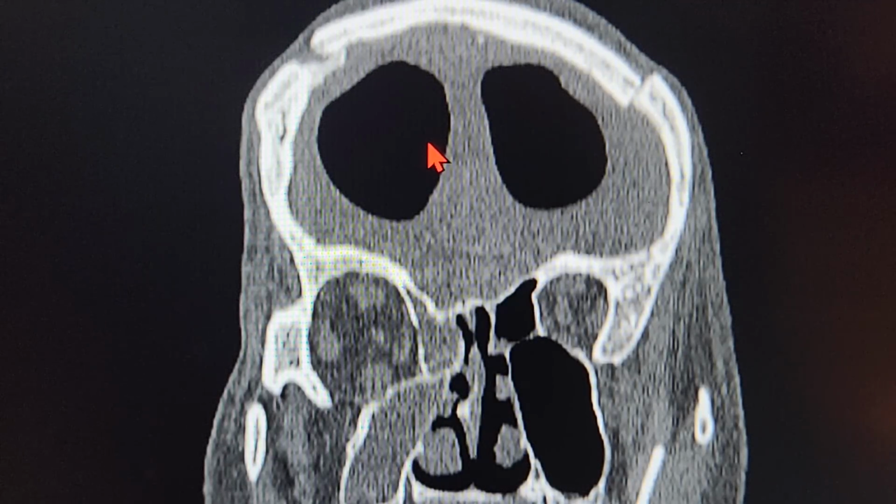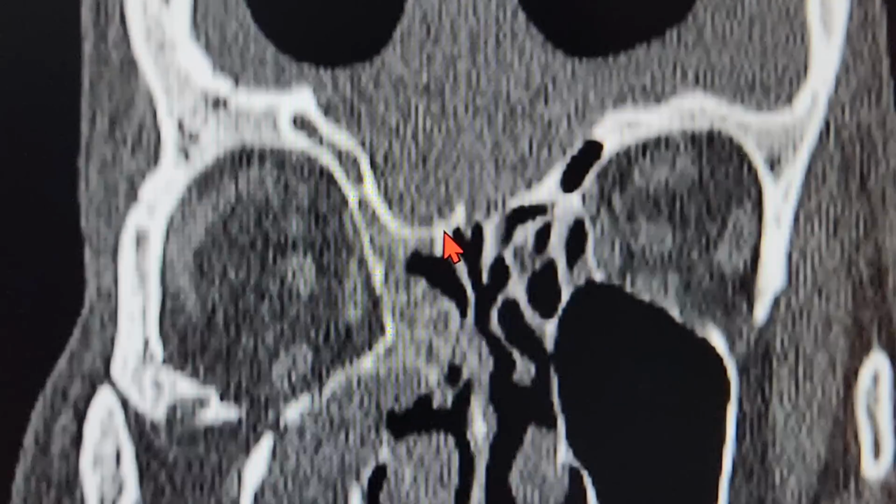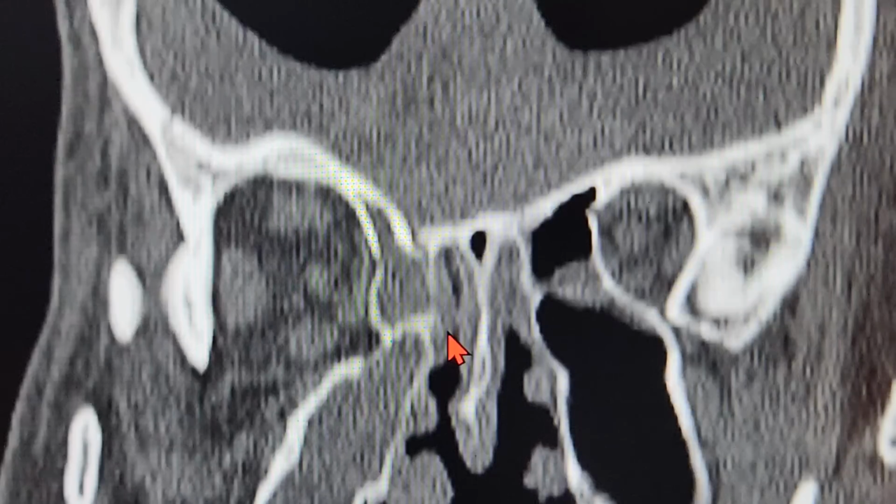The pressure from the external environment becomes more than the pressure in the intracranial cavity as a result of the skull base defect, so the air gets sucked in, gets pushed in because of the ball valve effect, and then starts creating a buildup of air inside. So that was the probable site of the defect, which we may have to encounter.